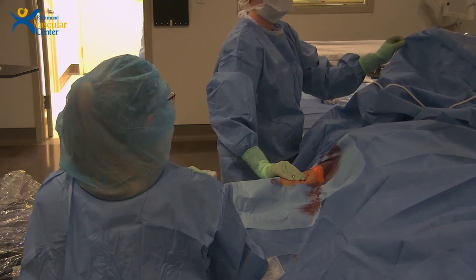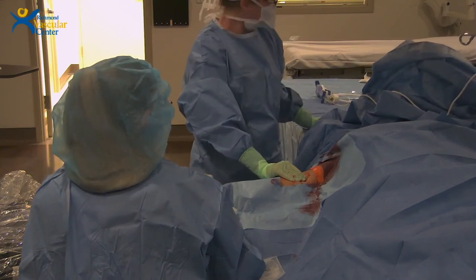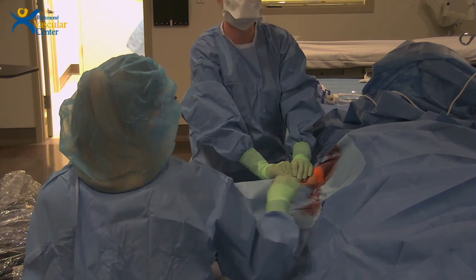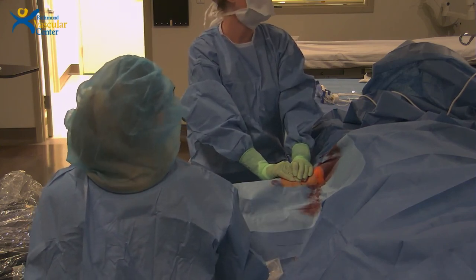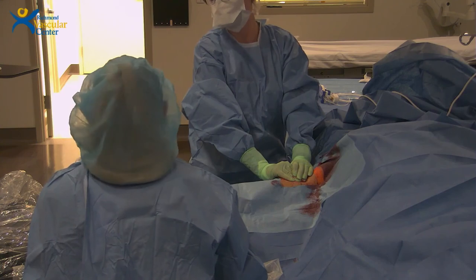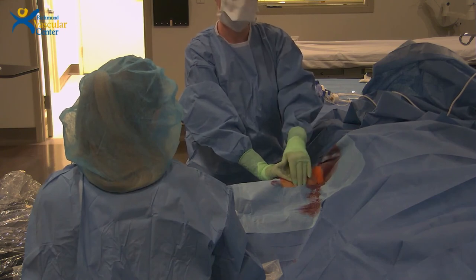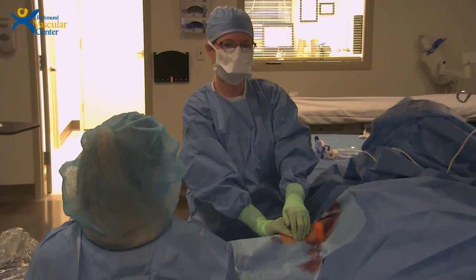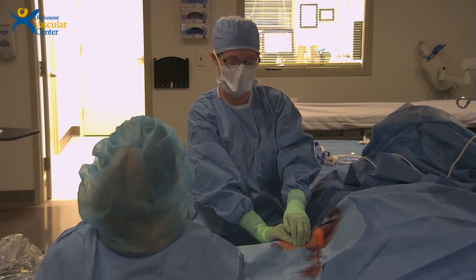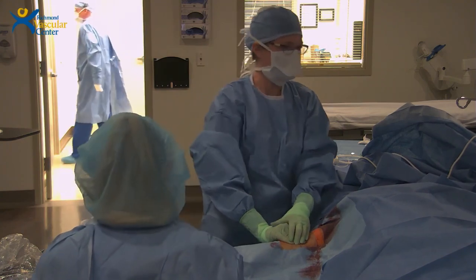Like in this patient where the cephalic vein looked really poor on the mapping, after the block today that cephalic vein looked a lot better. This cephalic vein may surprise us, even though it was measuring just a little over 2 up the arm. If it measures 4 at a week, we'll preserve this cephalic vein and use it as our primary target vein. It's a good time to check and recalibrate what you want to do. Make sure the patient doesn't have any bleeding or pain or neurologic problems, doesn't have steal. There are all the things you want to make sure they don't have.